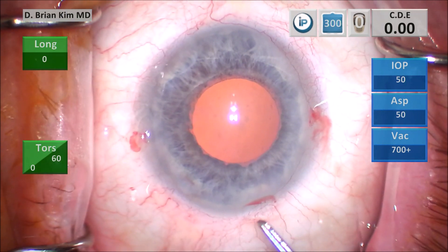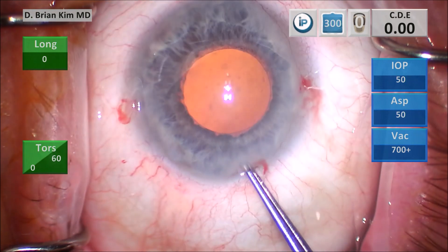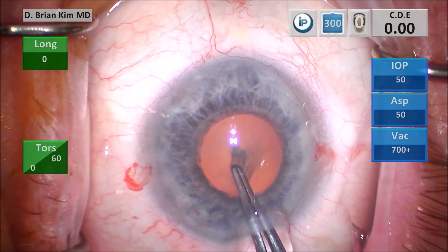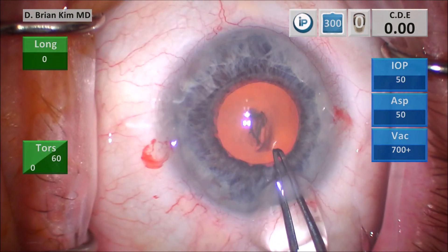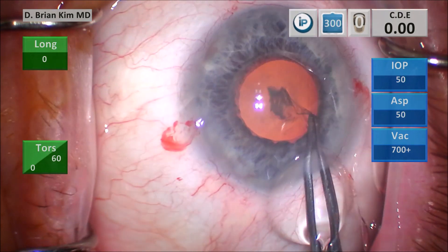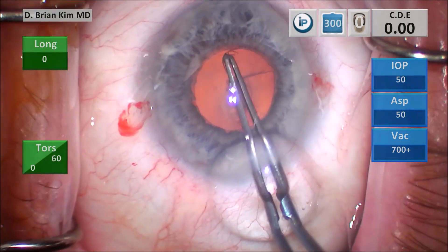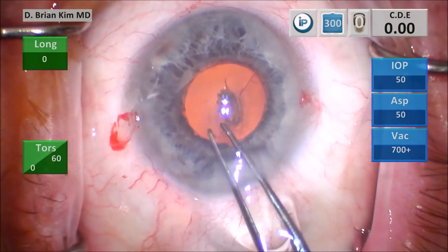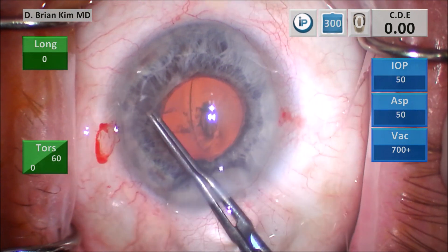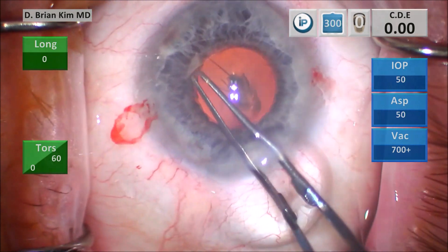This is my capsulorhexis technique using the forceps to puncture the central anterior capsule, pull centrally, and then grab on the right side of the capsule to create a flap, going around circumferentially. I want to be a little bit larger than the pupil size here, because this is somewhat of a small pupil.